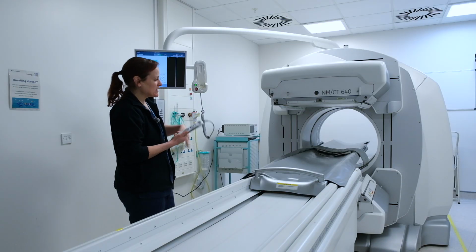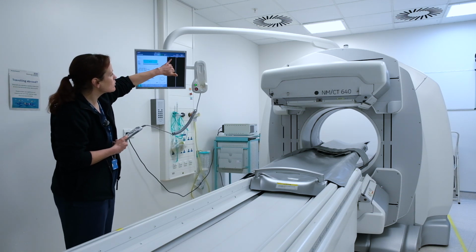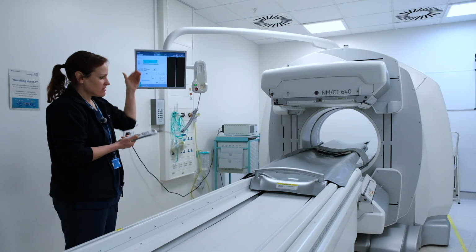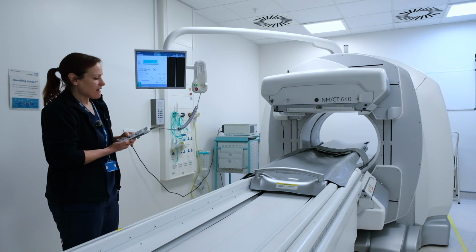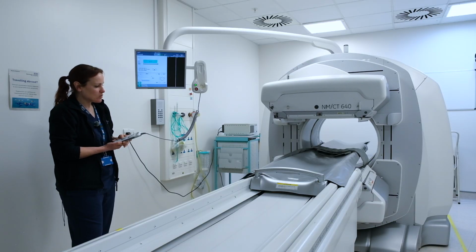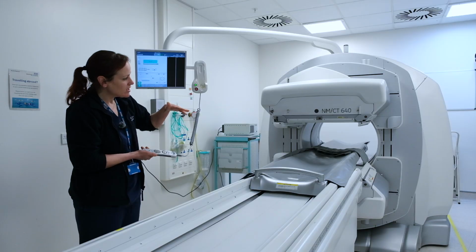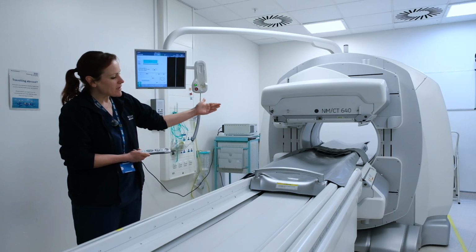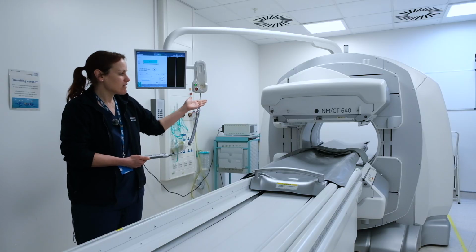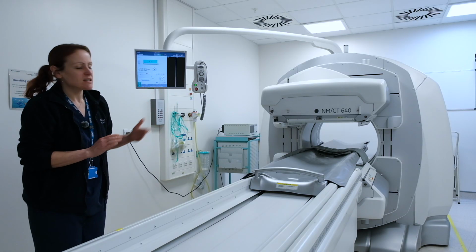So once in this position, we would ensure the top of the head, if we were starting from the head, is all visible on the PPM here. If we were happy, the camera heads would then move in, and then as the patient was happy, we would start the scan, and the body contour would then continue to work, so the camera heads would come as close as they can to the patient, but without touching them, and the bed will just gradually move outwards until we've scanned the patient from the area of interest that we've wanted to acquire. So most of the time, like I say, that would be from the head to the bottom of the feet.